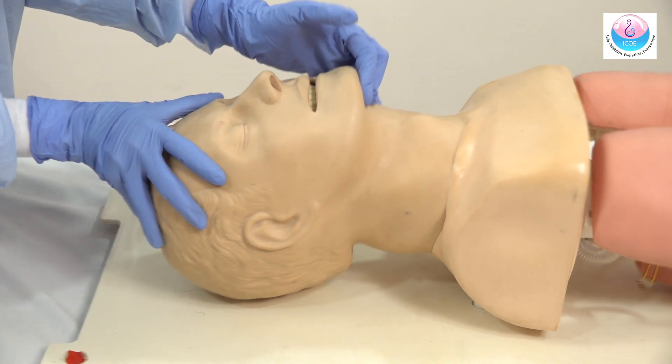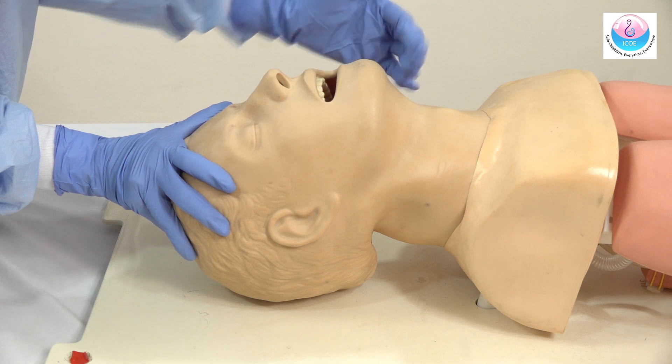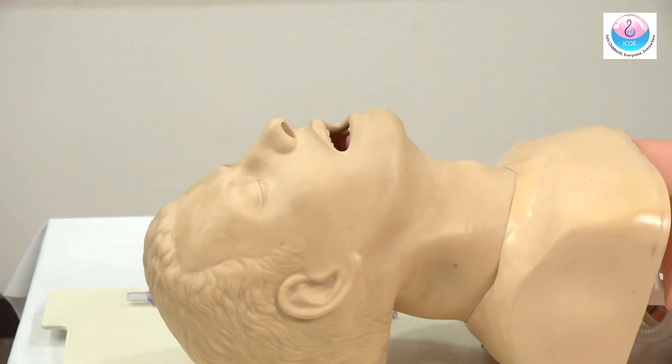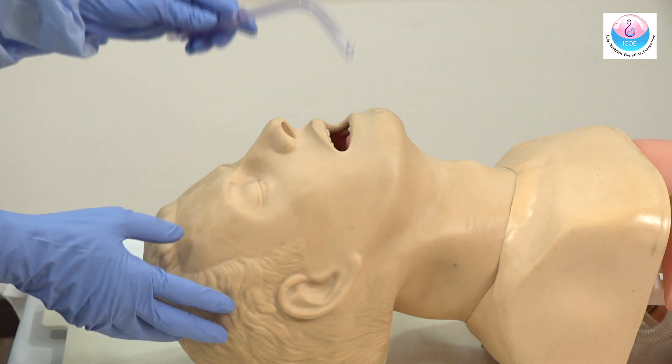Open the airway by tilting the head and lifting the chin. Jaw thrust further opens the airway and prevents the tongue from obstructing the upper airway. Oropharyngeal suction is useful to clear the airway of any obstruction.